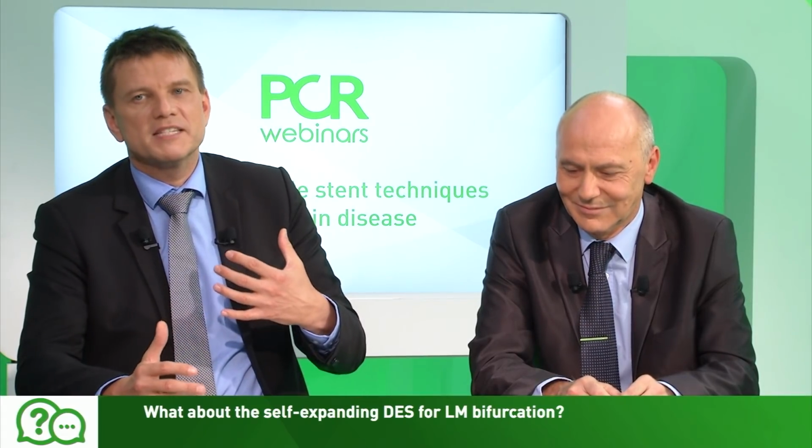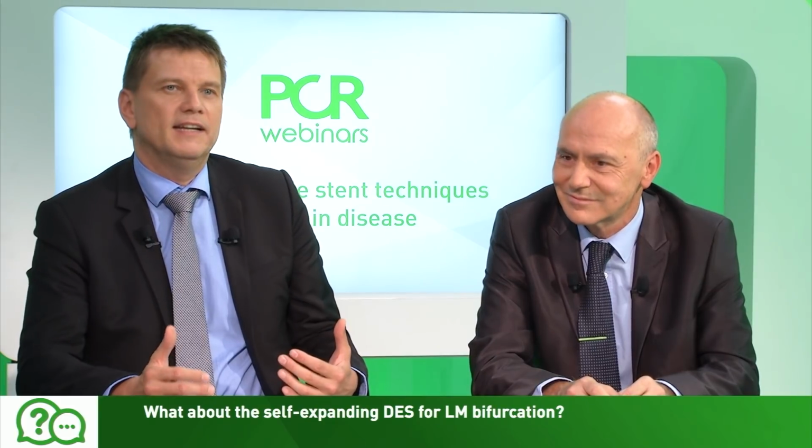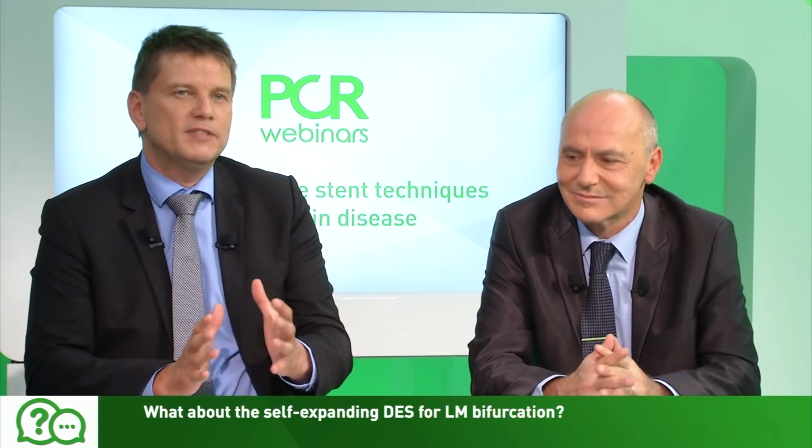With the dedicated stents, I have a little problem. We tried many of them. None of them showed an advantage. And in the end, they somehow mimic the anatomy. But I think we are better at mimicking the anatomy because we don't have a prefabricated stent. We try to tailor our stents to the individual anatomy. And I think this is better.